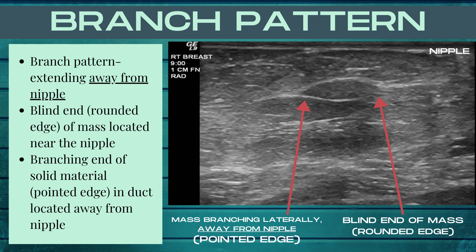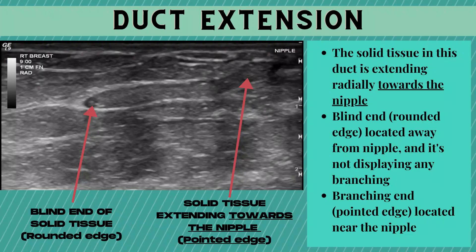This next ultrasound example shows duct extension, where solid tissue in the duct is extending radially towards the nipple. I want to look for my blind end — the rounded edge — and then my branching or pointed edge of the mass within the duct. The branching or pointed edge is located near the nipple, and the blind end — the rounded edge — is located away from the nipple and is not displaying any branching. So this mass is extending towards the nipple instead of away from it.